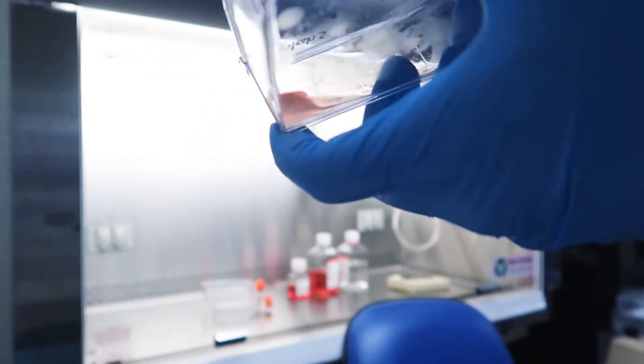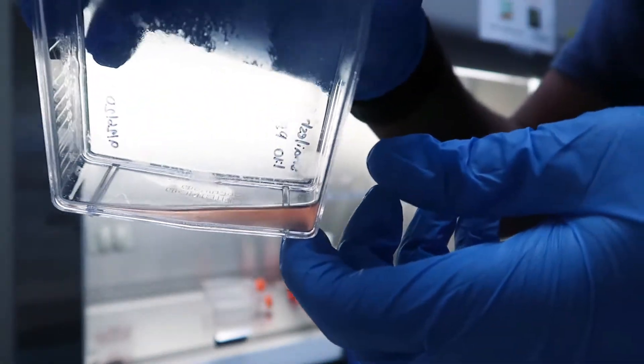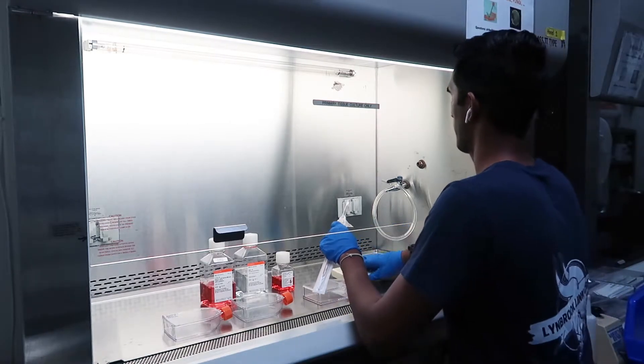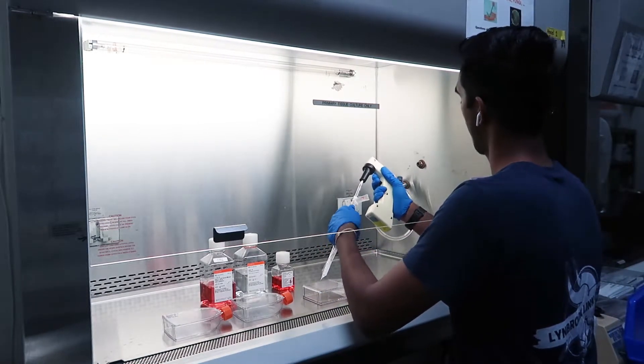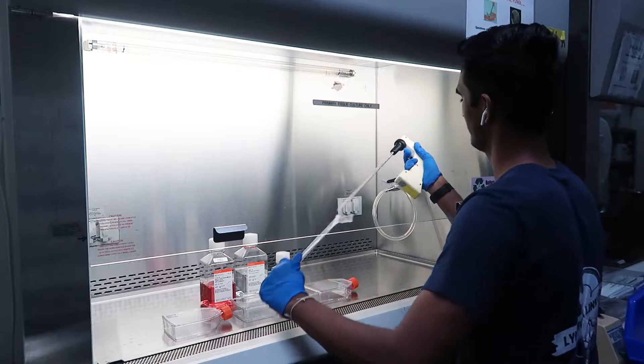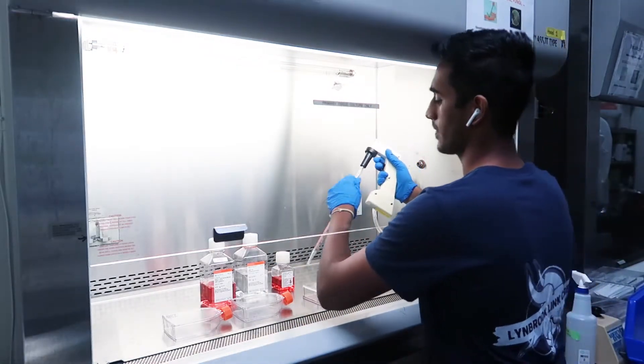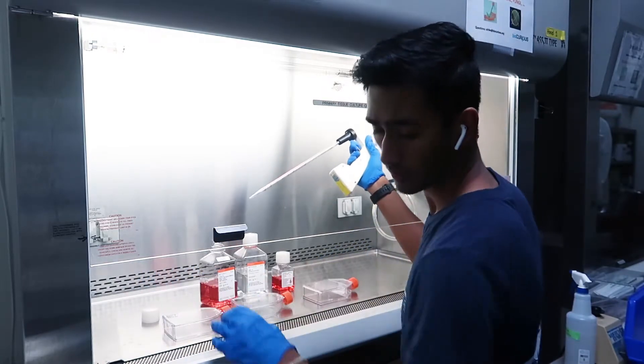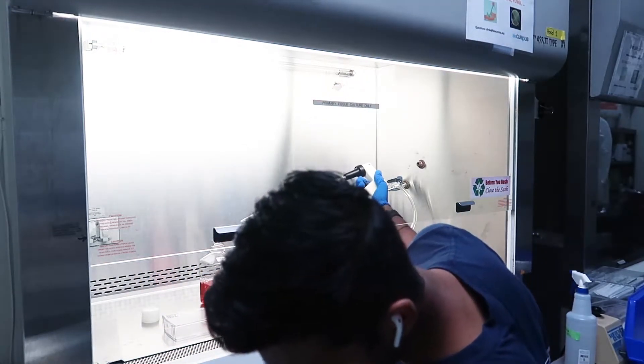When you remove your flask from the incubator, you should check by tilting the flask to see if the cell monolayer slides down. The next step in this process is collecting the cells. We're going to add seven milliliters of the medium to the flask with trypsin EDTA.